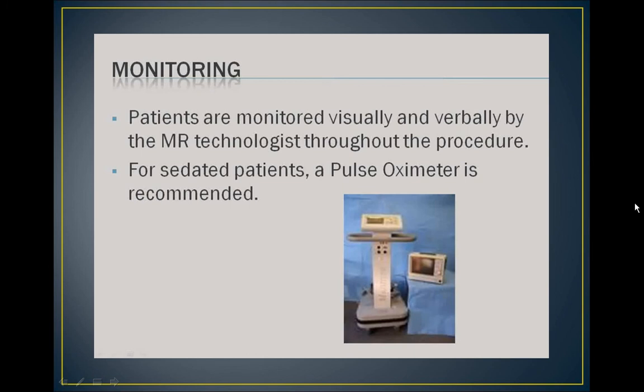Every MRI technologist should know their department's emergency procedures in case of a patient emergency. The patient must be immediately removed from the MRI suite and placed into a holding area. The radiologist on duty should be alerted next, and a code should be called if necessary. Institutions should have an emergency protocol in place for these situations, and they should be practiced to ensure readiness if an emergency arises.